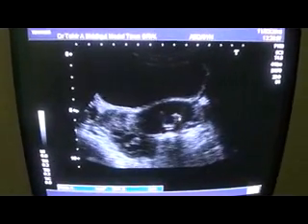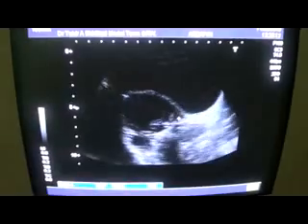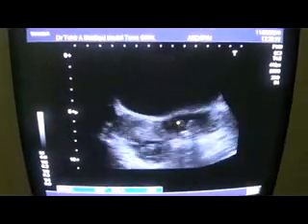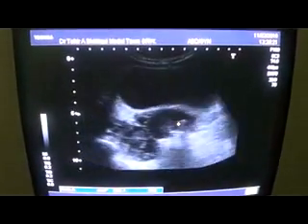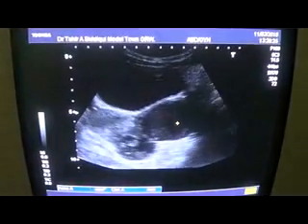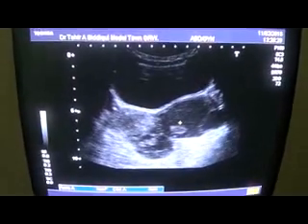These echogenic areas are giving posterior shadow, so these are calcifications within this echo-filled cyst. This finding is very much consistent with left tubo-ovarian abscess.